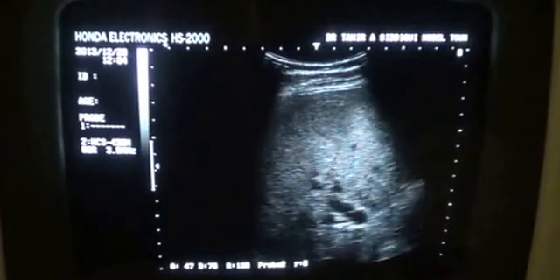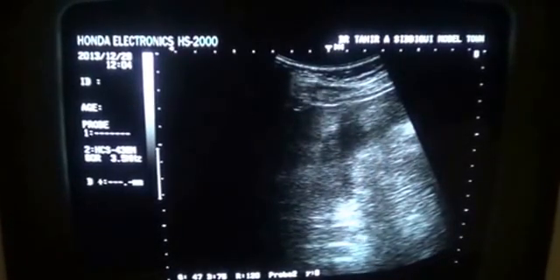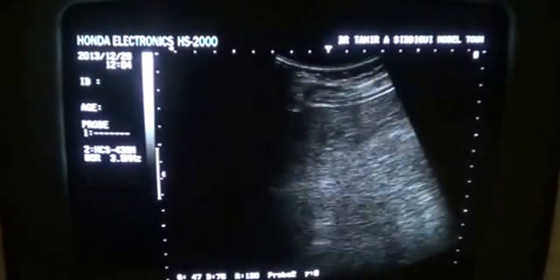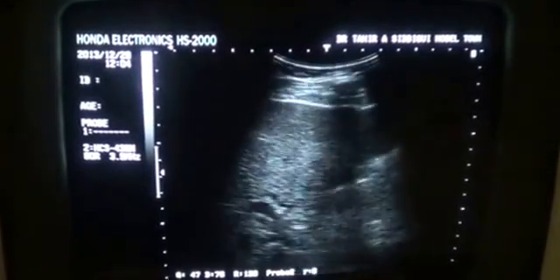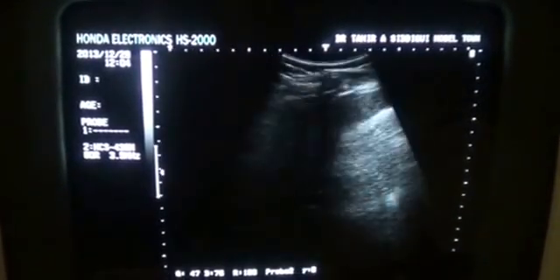Here you see the dilated ducts and gallbladder ducts. This is the portal vein, this is the common bile duct. These are the echogenic materials seen in the distal portion of the CBD.